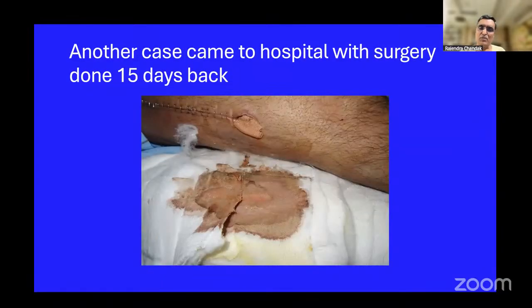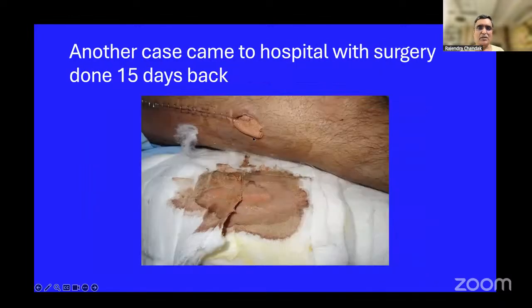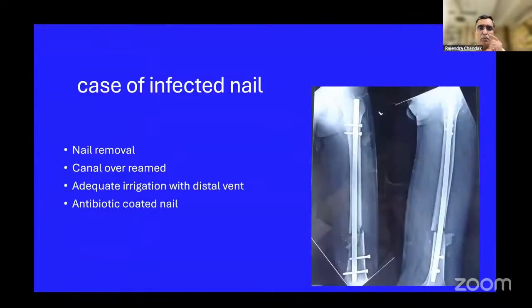This patient came just 15 days after the procedure. This was an open nailing which was done for him. And with such a massive amount of infection, I thought retaining the nail was not good. So we changed him to an antibiotic coated nail, and that patient also over a period of time healed very well. So this is a patient who had an infected nail.